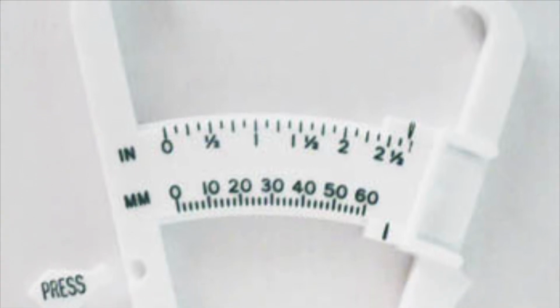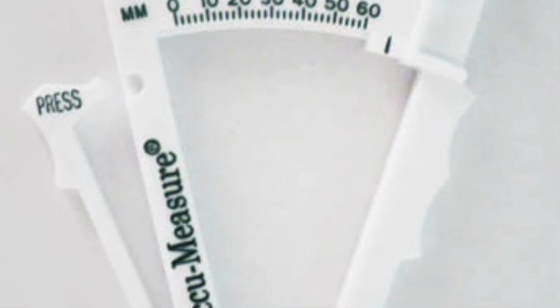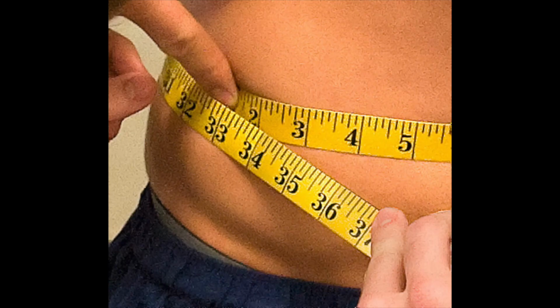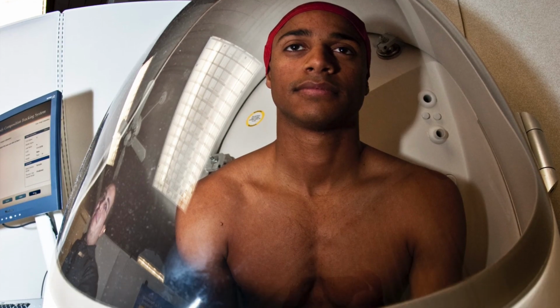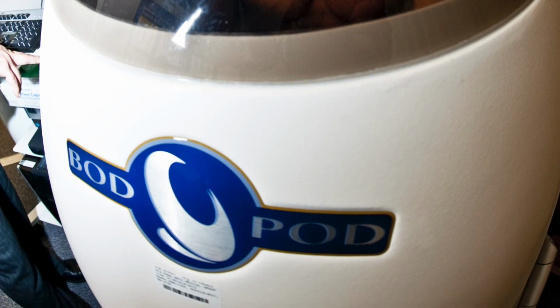In addition, basic skin calipers are a more cost-effective way to determine body composition, as they involve calculating lean body mass by simply measuring the skin fold thickness of the layer of fat just under the skin. Skin calipers, however, lack the accuracy that the air displacement plethysmography with the BodPod supplies due to human error and generalized equations. With that being said, ADP has a high level of accuracy, is easy to use, and has a relatively fast test time.